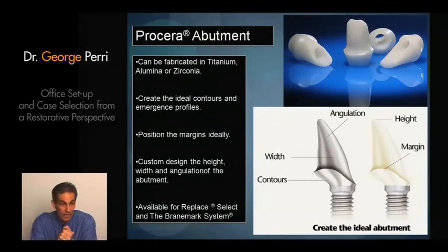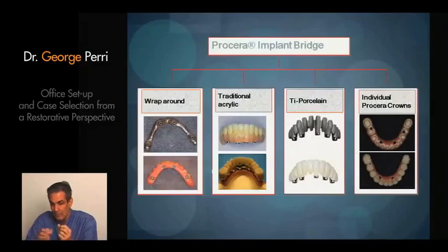I like many times to use a ceramic abutment anteriorly. As I proceed into higher stress areas, I still opt more towards using a titanium type custom abutment of this type. We can make these abutments for hex-headed implants, and also internal connection replace type.